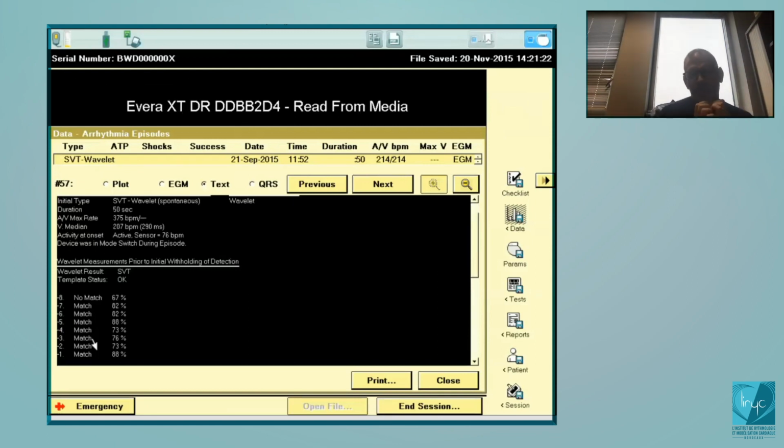Okay, so now let's consider a patient with fast atrial fibrillations, like in this case. First of all, the counters. If you remember, last week, we were discussing about the counters. In the VT zone, every cycle out of the VT zone will reset the counter. So in many cases, you don't even need discrimination, because with the VT counter, you will not fill the VT zone, okay? But let's consider at one time there is a stabilization inside the VT zone for a quite long number of cycles.